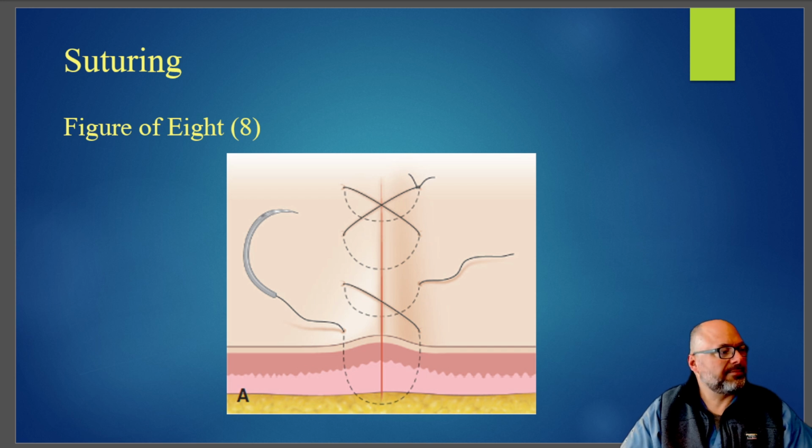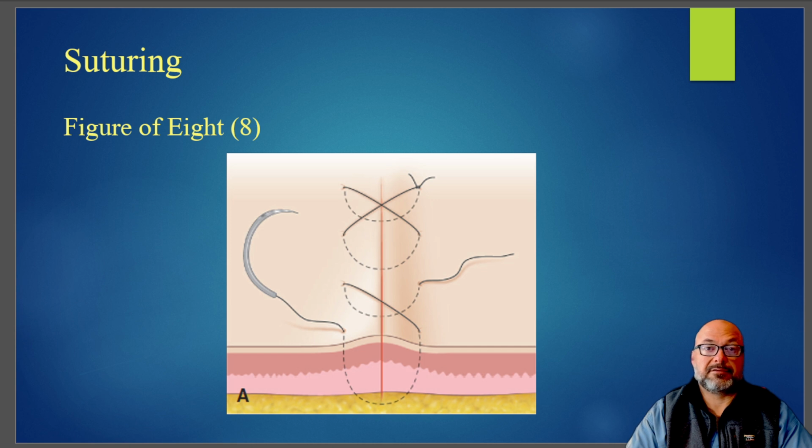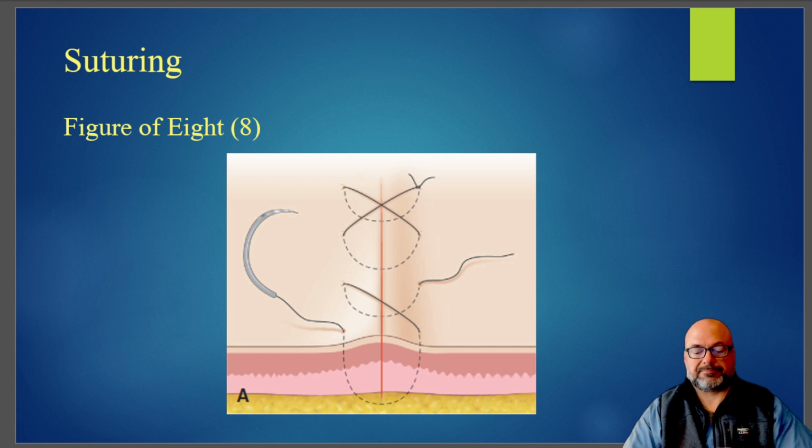All right, so that's a bit of an odd subcutaneous closure because, as I mentioned in the video, with the skin not really being attached to the underlying tissue, it ended up really being more of just a kind of pseudo subcuticular closure of the meat itself, not the skin. I trust that with what you've seen and done yourselves previously throughout med school, this was just building upon what you've already seen and probably done. And we'll have the chance to practice this a lot.